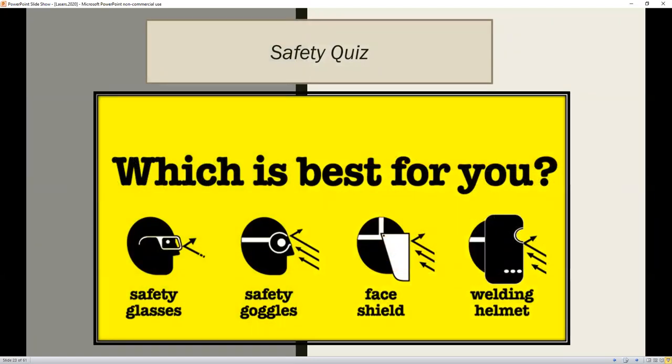So who wears the safety glasses? So it's going to be both the patient and the clinician. Both need eye protection as well as your instructor, because you will be doing lasers. Whenever you do laser in clinic, you'll be having a skill evaluation performed and an instructor will be watching you. So you need three sets of safety glasses.